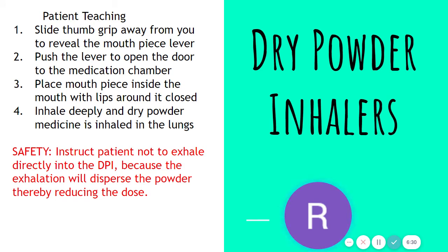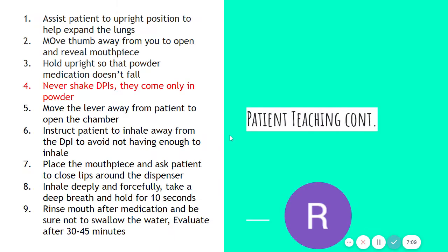Take a deep breath and the dry powder medicine is inhaled into the lungs. For safety precautions, we instruct the patient not to exhale directly into the dry powder inhaler because the exhalation will disperse the powder, thereby reducing the dosage the patient gets.